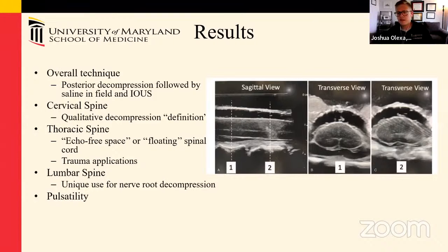Of both of these, in the cervical spine and thoracic spine, they did note that while you can see this on the imaging study and provide that real-time decompression of the neural elements, many of these studies provided mixed or inadequate data suggesting any relationship to neurologic outcome afterward. There's kind of a mixed bag across all of the studies in the review. Some of them say sometimes patients get better, some don't, and a lot of them don't comment on that because they're more focused on their radiographic criteria.